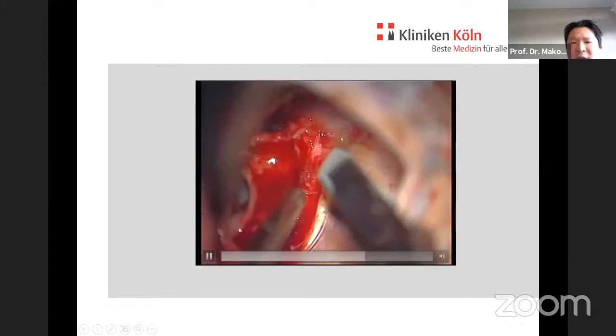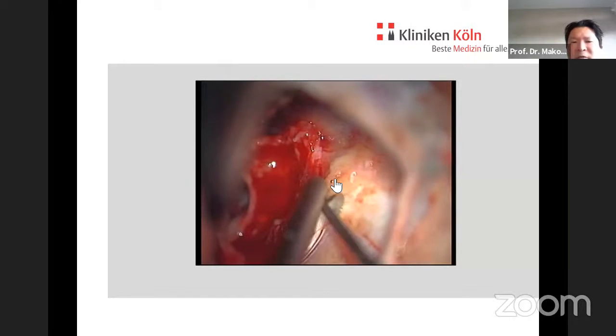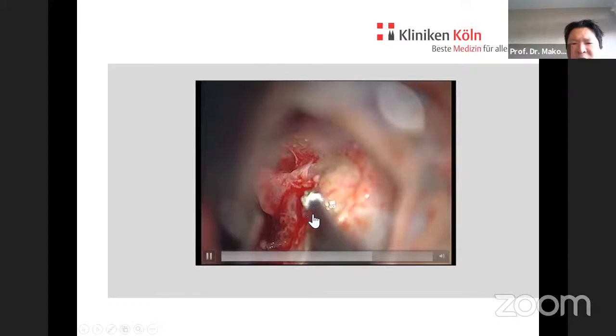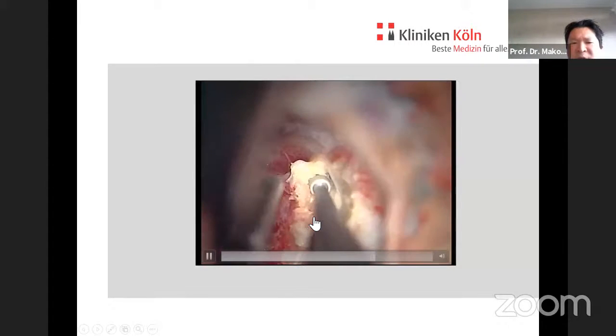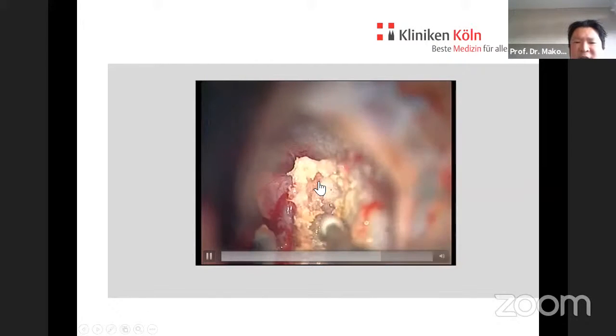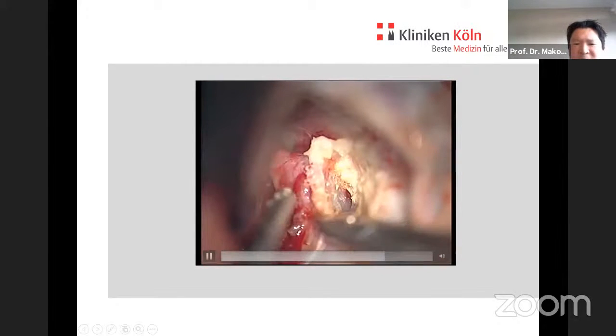So, and then now you can open the internal auditory canal. I always leave some tumor here at the porus and do not proceed here because the tumor is very adhesive in a lot of cases here at the porus. So I start with the drilling of the internal auditory canal.